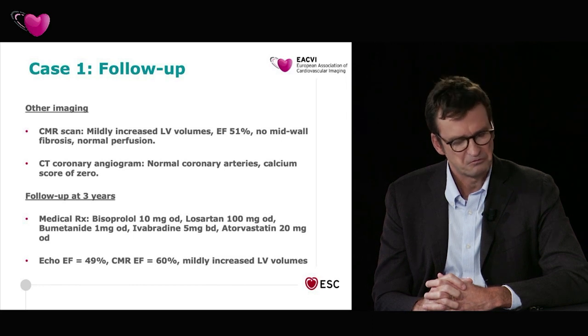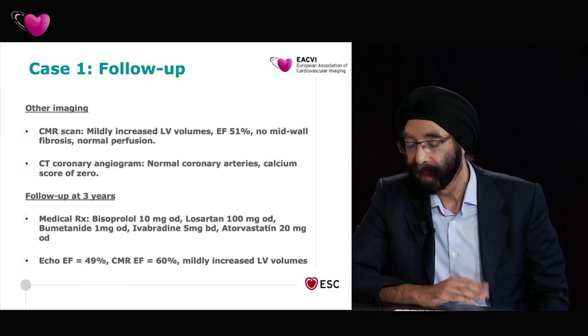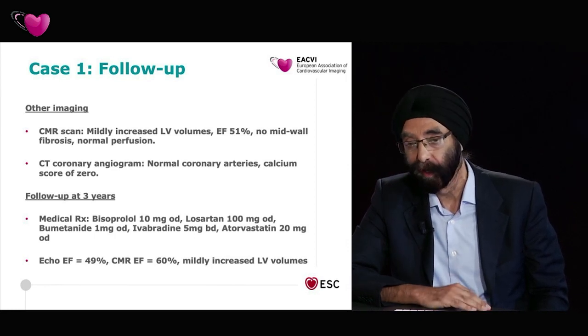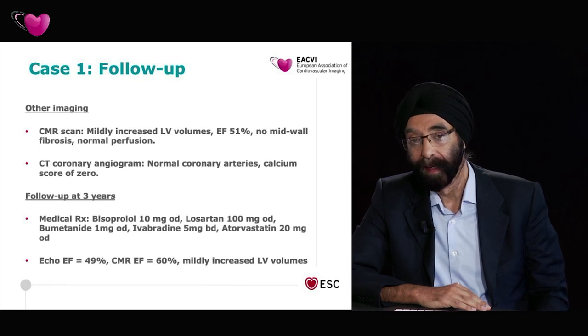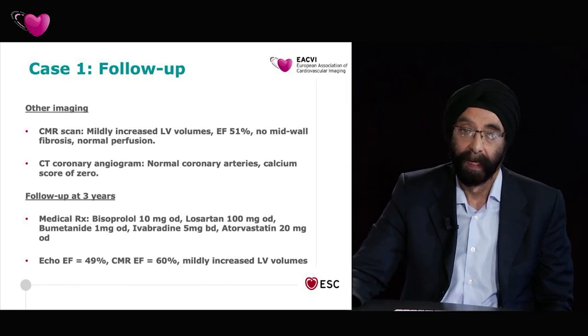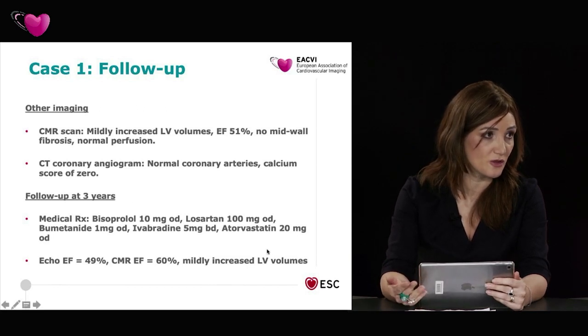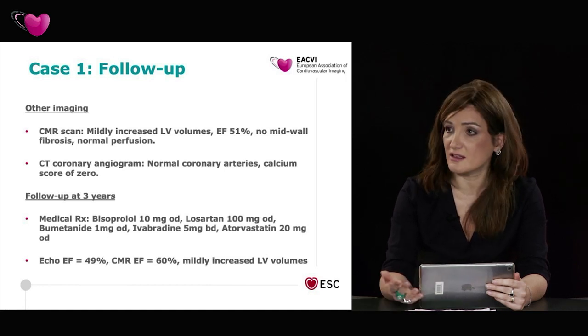Right? Yeah. And the other thing I think relevant to this case is that the patient had morbid obesity, and we have shown that in all comers with a body mass index over 35, we have a 96% feasibility of doing stress echo with contrast. And this is in all comers in standard clinical practice. This is an added value of contrast because without it, of course, it is not feasible. The pictures are not good enough to have a diagnostic study, do you agree, Nicole?